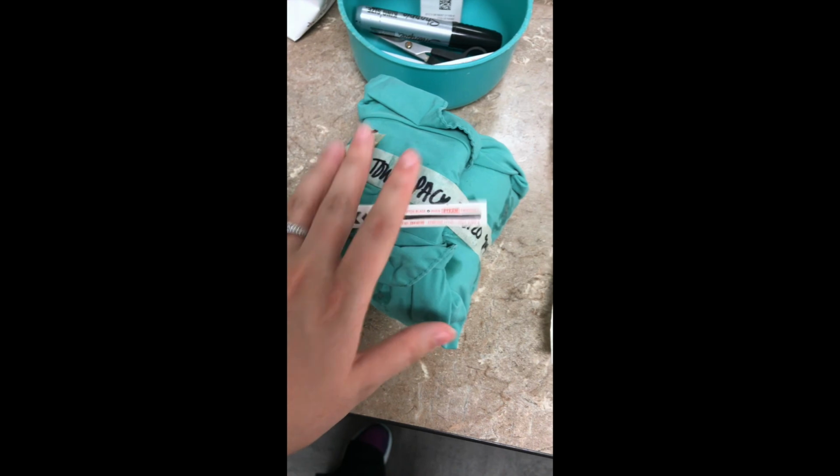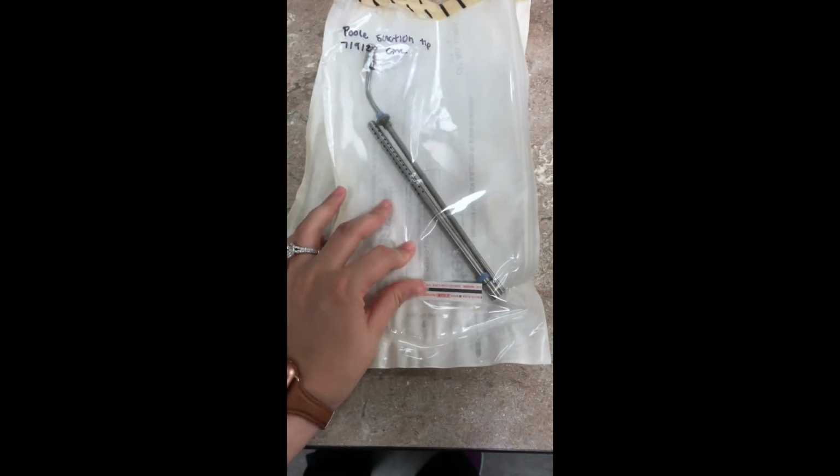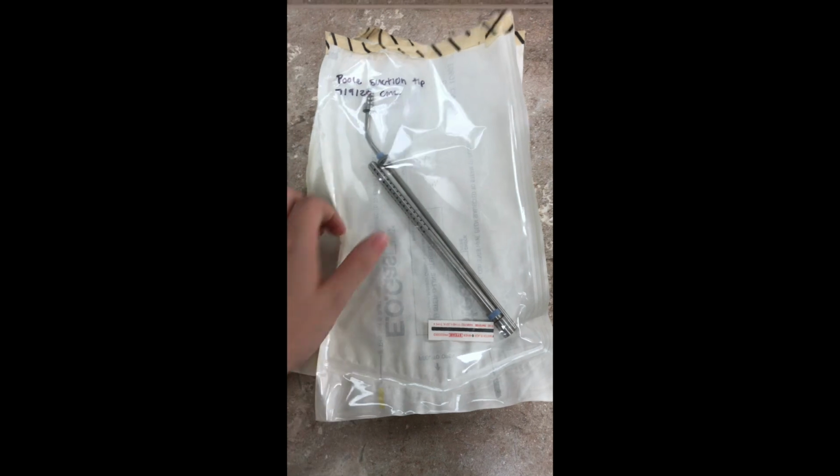I'm not going to open that, but you can see through this pack the tape has turned black, and your indicator strip that is inside the pack is black as well. That's how you know that your pack has been sterilized.